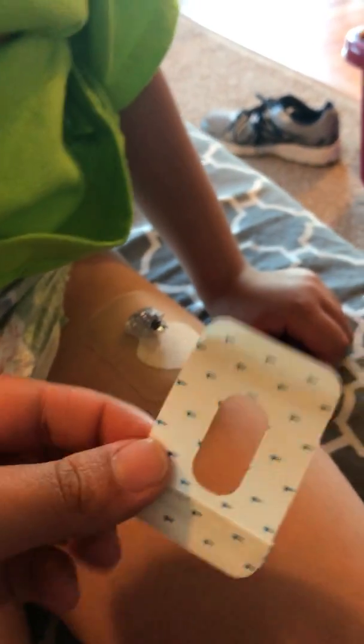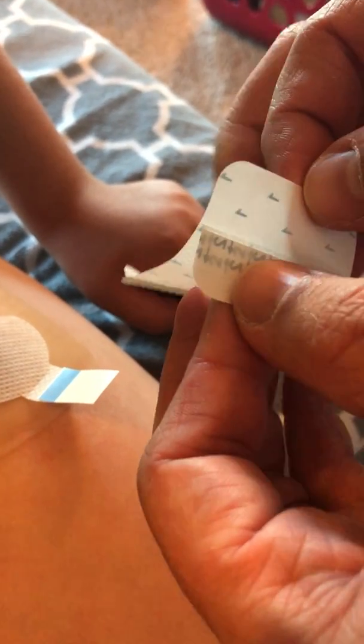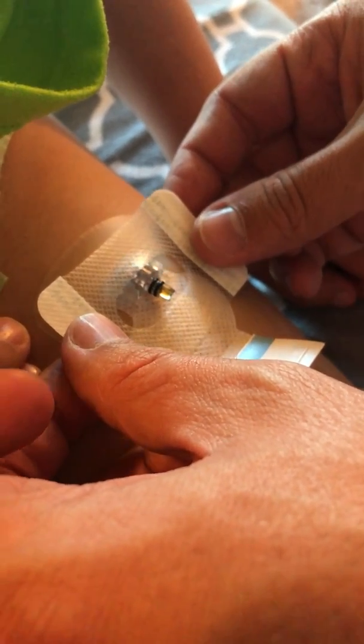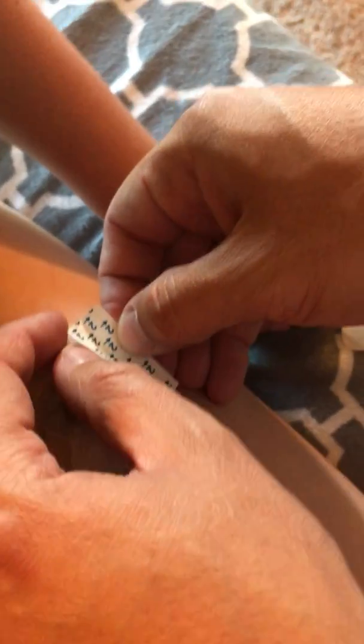Okay, now we get this piece here. This adhesive Isaac's allergic to, so when Jason puts it over, you'll see here there's the number 1, that's the side you take off first. You've got to be careful because this can get sticky, but you kind of put it over that part to hold it in place and get that down. The really important thing is that you keep that adhesive on the Tough Pad. So sometimes you have to fold it a little bit, because if that adhesive gets on his skin, within a couple days he is itching and it falls off because it really hurts him. He gets a bad rash.